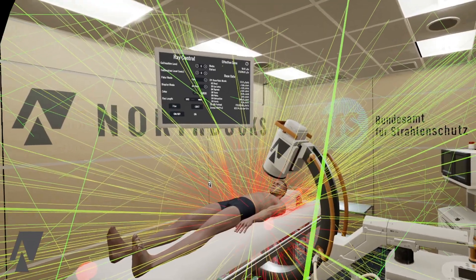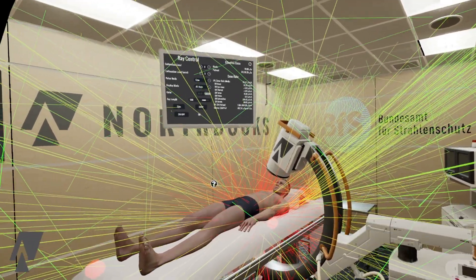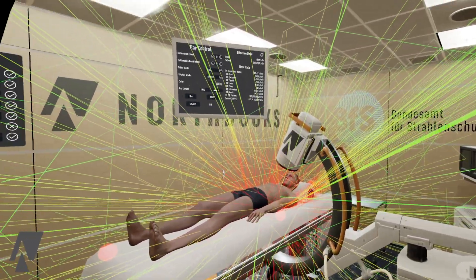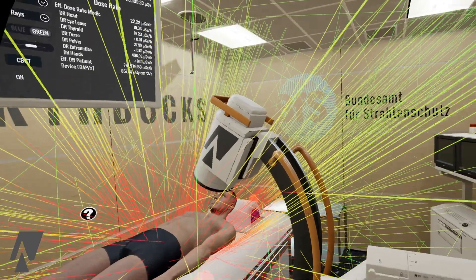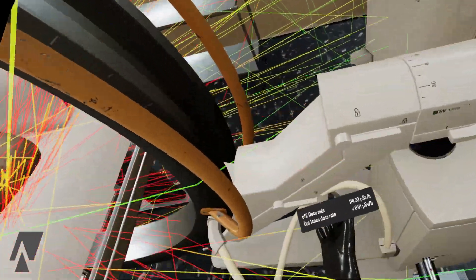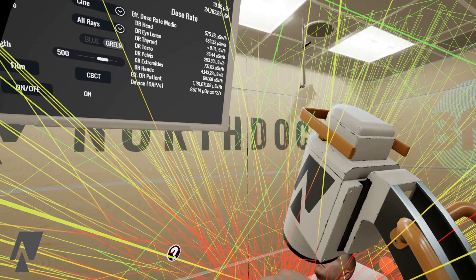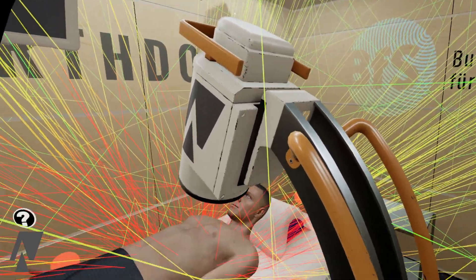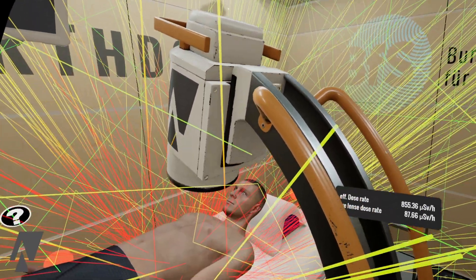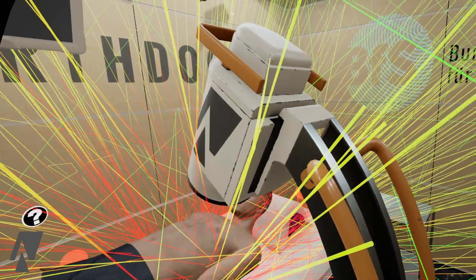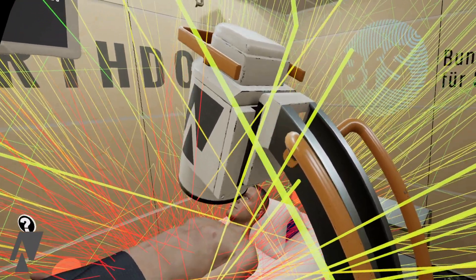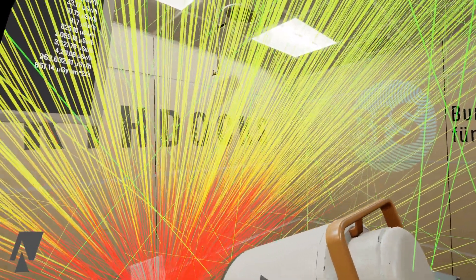I can also adjust the different portions of the C-arm manually. I unlocked this axis and I can now move it freely, and the radiation will follow the new orientation of the device.